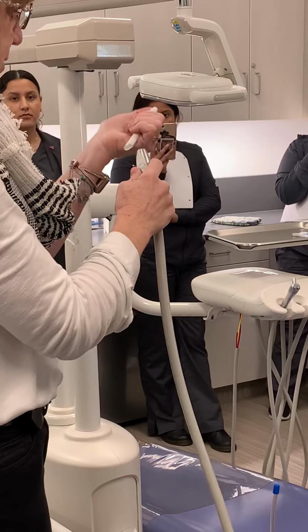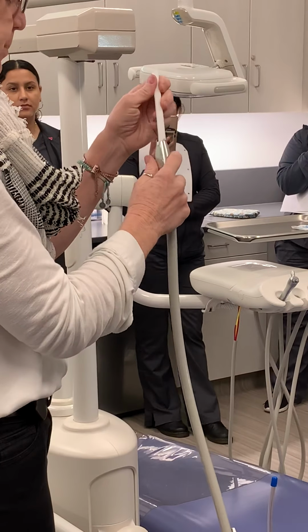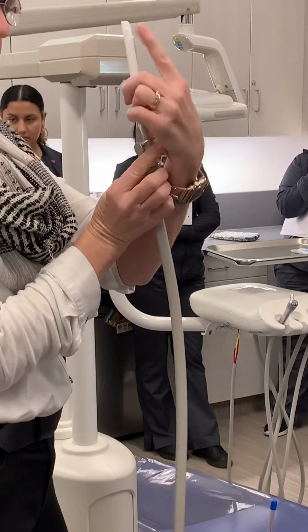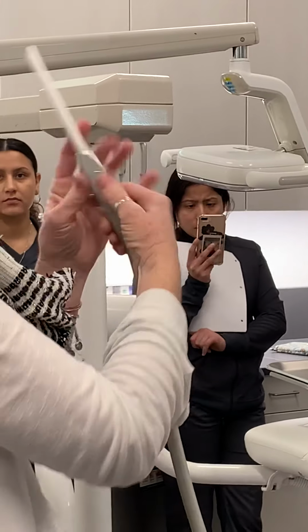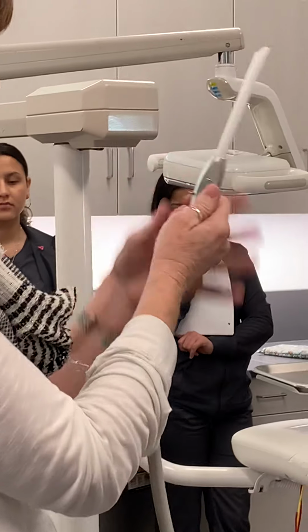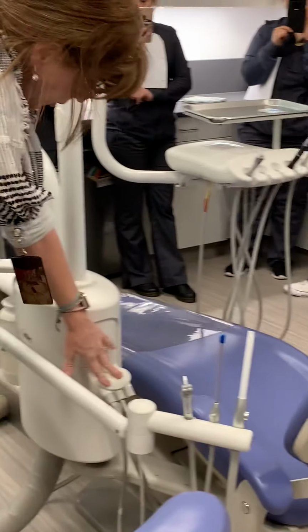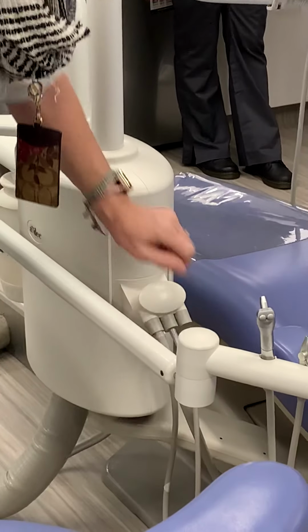I think it's easiest to remember, right? It picks up blood, water, saliva, and debris, and the little hole goes outward so that if you get the cheek or the tongue, it lets you release it easier with the pressure, okay? This is the filter or the trap where all the gross stuff goes.